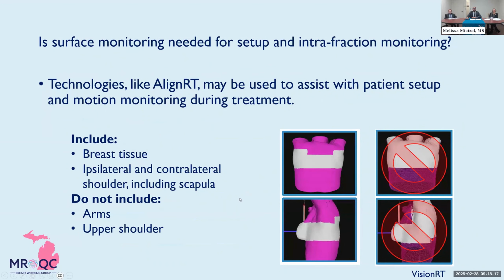The next question that often comes up, is there surface monitoring needed for setup and intrafraction monitoring? So there are technologies like AlignRT that may be used to assist with patient setup and motion monitoring during treatment. What you see on the right is an example of guidelines provided by Vision RT, which is the vendor for AlignRT, on how to contour the surface of prone patients.